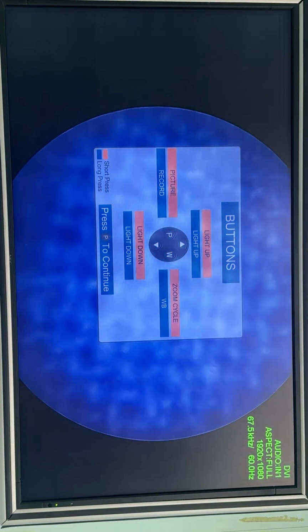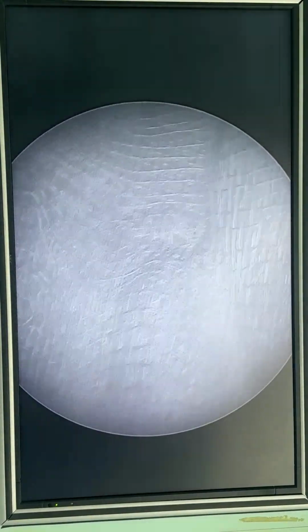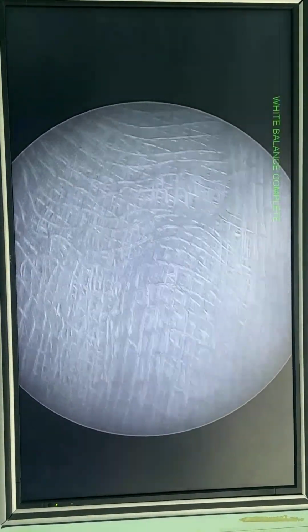So now we'll go with the resectoscopic technique. For this, serial dilatation will be carried out. All aseptic precautions have been taken, and I need to just swab it up after the ultrasound. Close up.